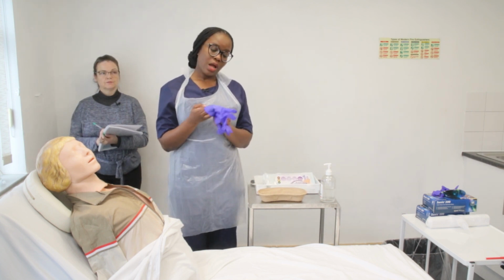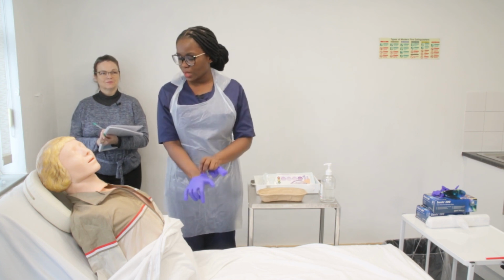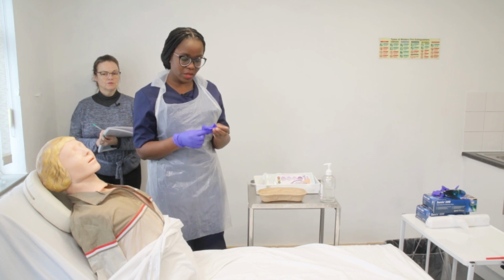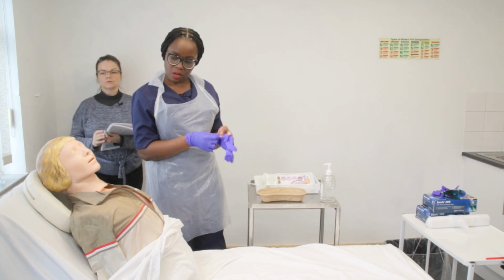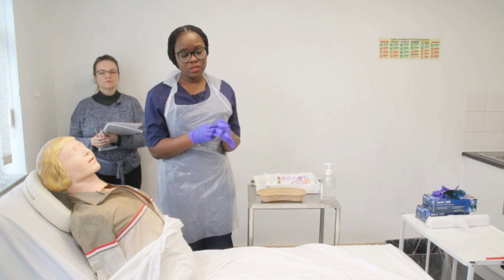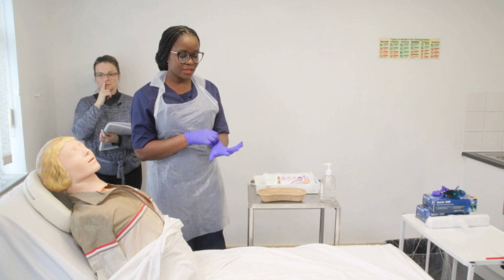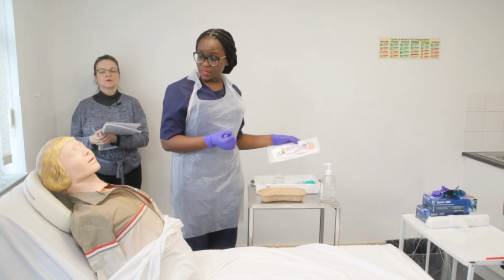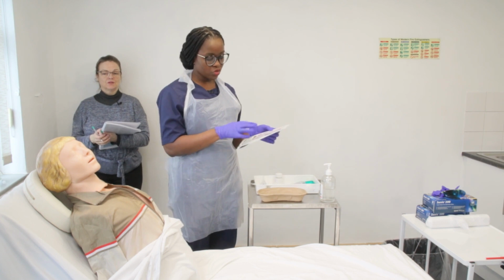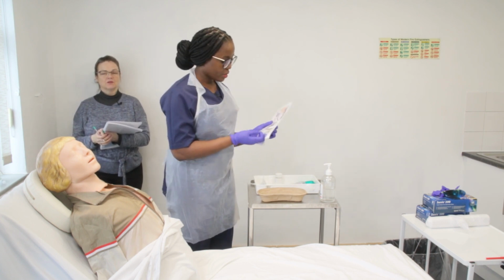Okay. So I'm actually going to check the patency of your nostril now. Is that okay? Yes, sure. Do you mind closing your left nostril and then sniffing with the right one for me? Okay, and do you mind closing the right one and sniffing with the left? Okay, and are both of them patent? Yes. Okay, and which of the nostrils would you like me to use? The left one, please. All right, that's fine.